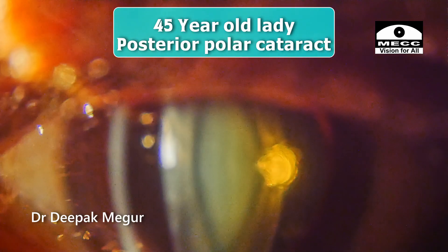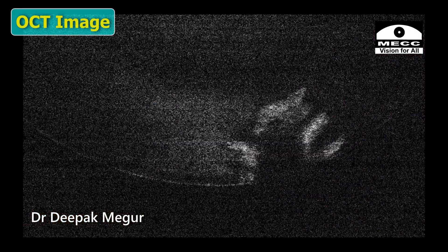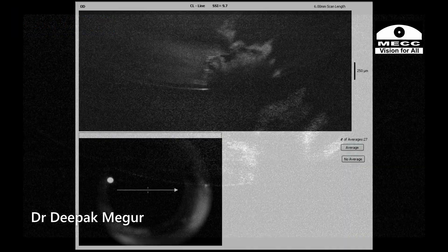This is a 45-year-old lady with a posterior polar-like cataract. We have a central nodal cataract with few ring opacities. I got the OCT of the lens done, which is suspicious.